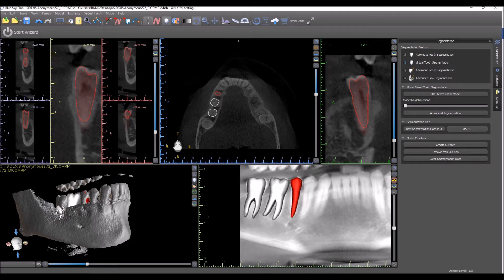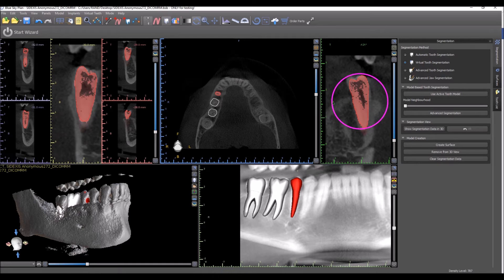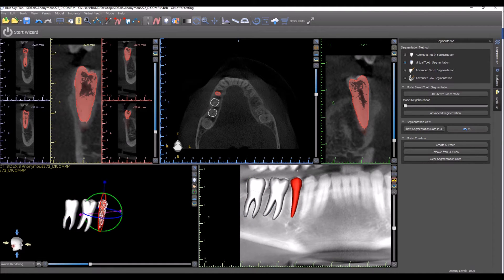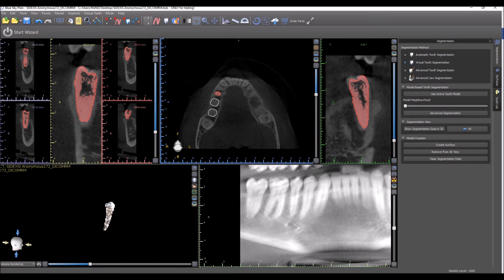Once we have the virtual tooth placed, in order to segment, first use virtual tooth segmentation — that's what we're demonstrating now. Then select 'Use Active Tooth Model.' You can see what the software does is it imprints the virtual tooth on the actual CT scan. If you want to change the model neighborhood, which would increase the area of the imprint and what's going to be extracted, you could do that, but I generally reduce it down to zero. Advanced segmentation will take us to a different option for advanced tooth segmentation, which we'll demonstrate in a different video. If you want to see the segmentation data in 3D before you decide if it's acceptable, you press the button and you can see how the segmentation is going to look — it's kind of like a print preview. If you turn off the virtual teeth, you can see how the segmented tooth is going to look.